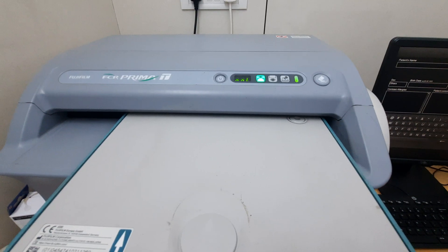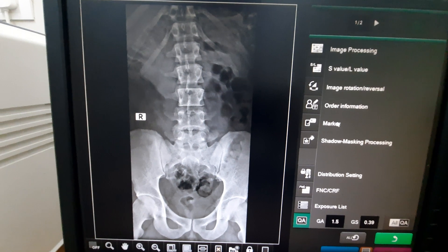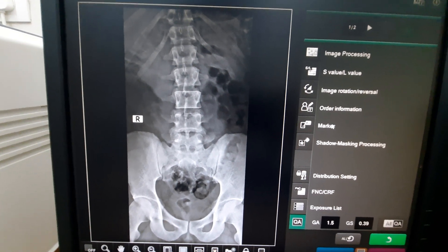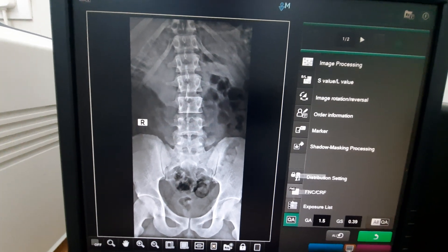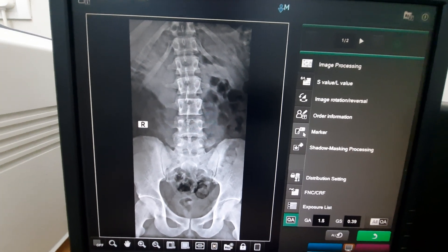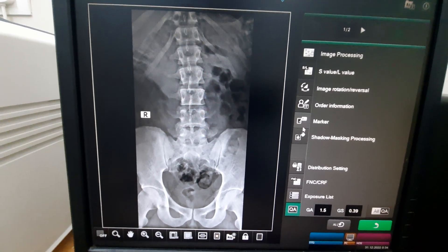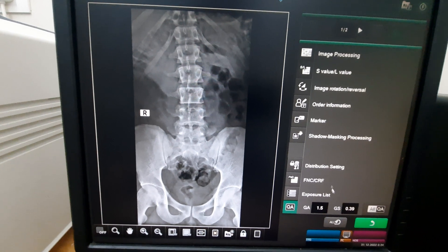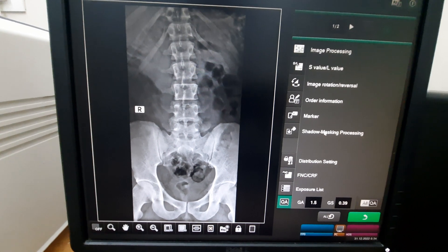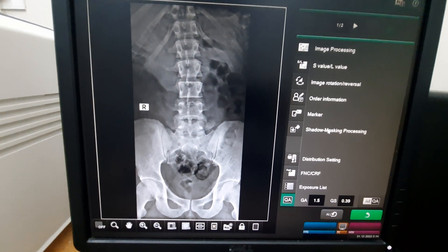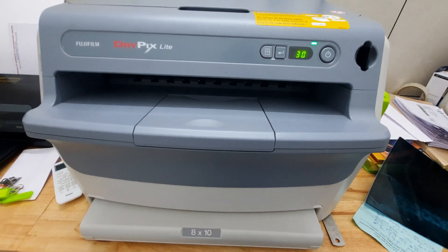We get the image on the monitor. Once the cassette is read, the image appears on the screen. Here you can see various tools used for processing the images — we can increase the contrast, adjust the brightness, and add markers. These tools are used for processing the images, and this is how we get the image on the computer system.